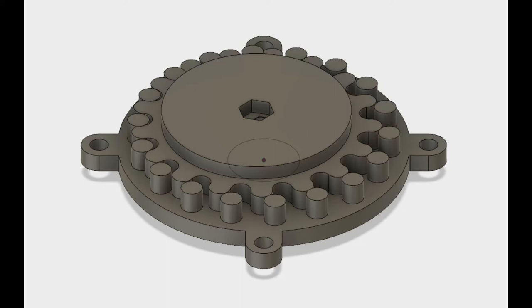Today we're going to design a hypercycloidal reduction drive used in an exoskeleton for after-stroke therapy. This is a project of a German student, and I'm going to design this reduction, a 1 to 300 reduction. It needs to be small, it needs to be light, and it needs to be 3D printed. So, I decided to go for a hypercycloidal reduction drive.